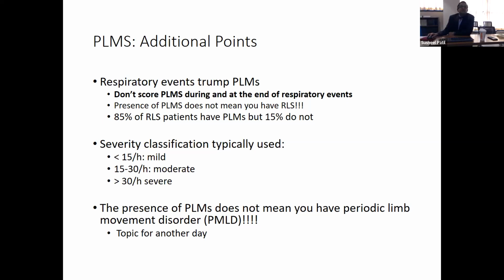Okay, that's what Dennis was adding in. Dr. Ockley is saying he 100% agrees that RLS is a history diagnosis, but if you see events that would meet PLM criteria during awake monitoring, that could be scored. So absolutely, no question about that.